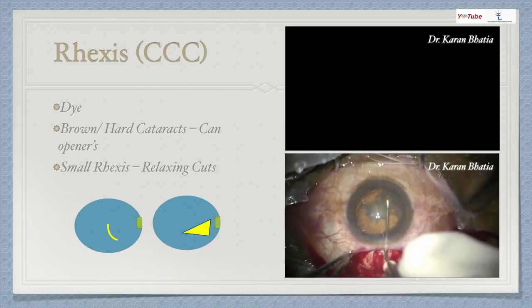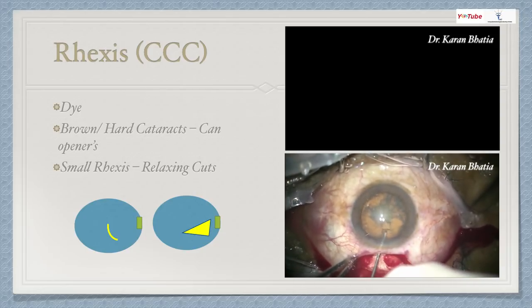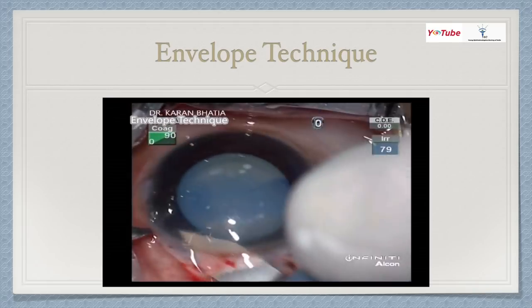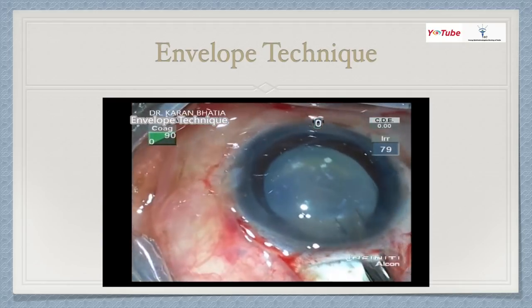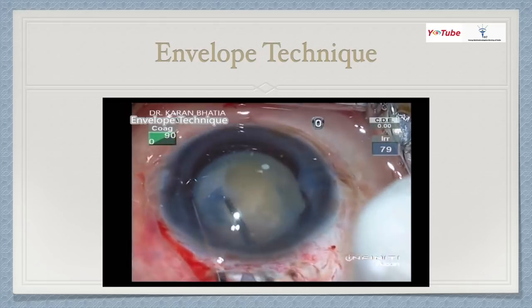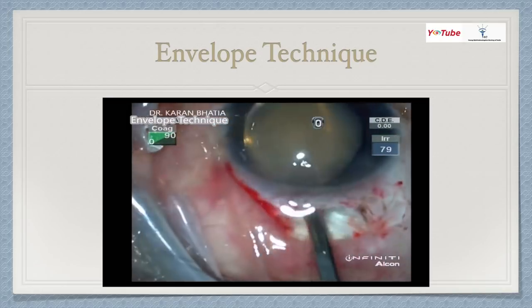One should also be able to do capsulorrhexis via the main port — you don't know when the situation will arise. When using the main port in SICS, press the upper lip to form the anterior chamber; pressing the lower lip will collapse it. Another favorite technique is the envelope technique, useful for hypermature Morgagnian cataracts. With the keratome, incise the anterior capsule, inject viscoelastic, then give two cuts with Vannas scissors. After injecting OVD, use Utrata forceps to complete a good capsulorrhexis. This is advantageous because these cases have very weak zonules.